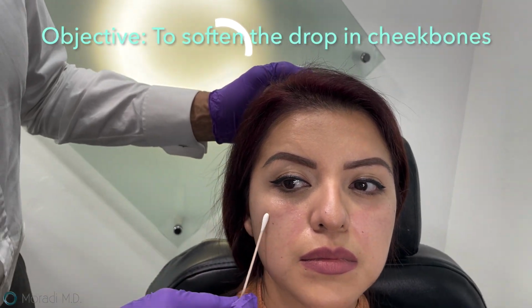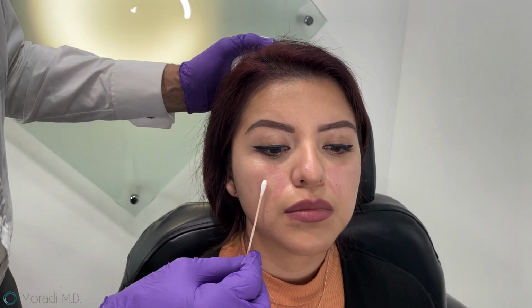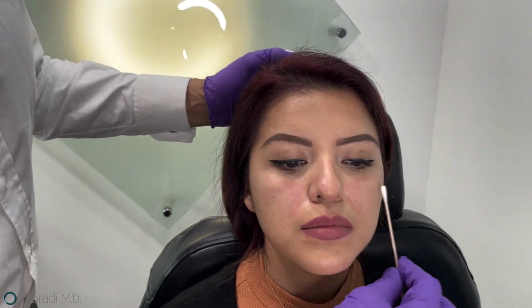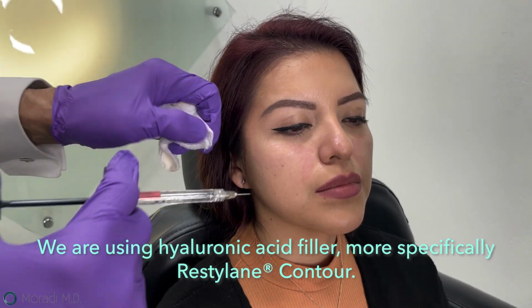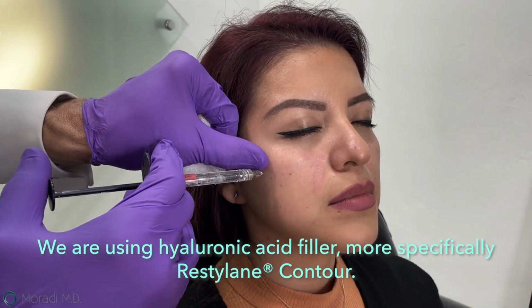triangle. Our objective is to make this so that it doesn't fall in this groove as it comes out a little bit and descends gradually. Instead of falling, we're going to make sure that it descends gradually. We're going to use hyaluronic acid. Start at malar eminence. That would be our start point.